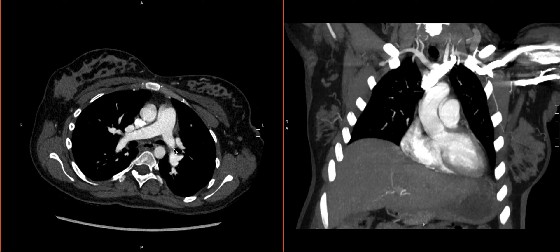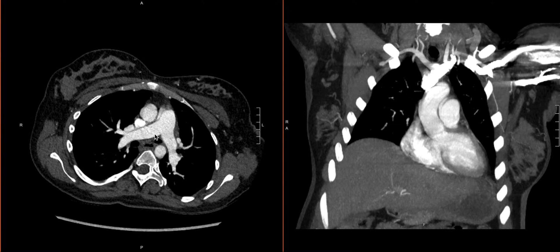The main will branch into the right and left main pulmonary arteries. From there, it's important to have a general appreciation where the caliber of arteries changes from the right pulmonary artery to a lobar artery. Then we'll have segmental branches and then subsegmental branches. These follow the path of the airway, which has very similar anatomy. Being incredibly precise about where the pulmonary embolus is has maybe limited utility — it's perhaps more important to big-picture explain the caliber of vessel you're in and generally where you are.